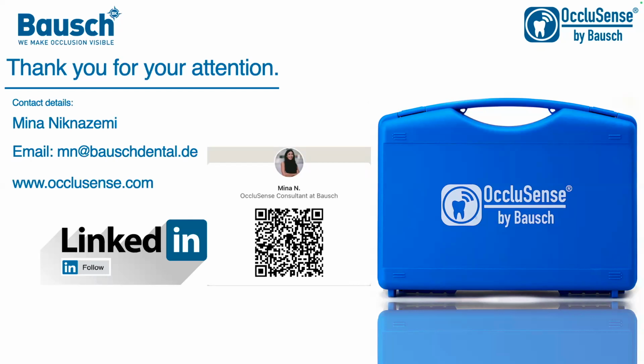Sometimes you lose your sensors because of the point contacts, which you are talking about as red contacts, where the surface area of your contact point is very small, and that actually punctures your sensor. So what do you do in your clinical practice to avoid this, or how do you go about it? If the sensor is punctured, definitely don't use it anymore.